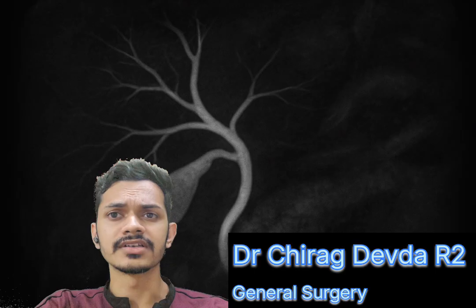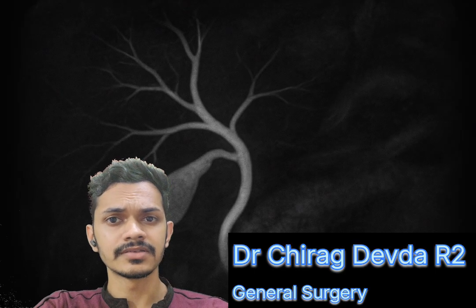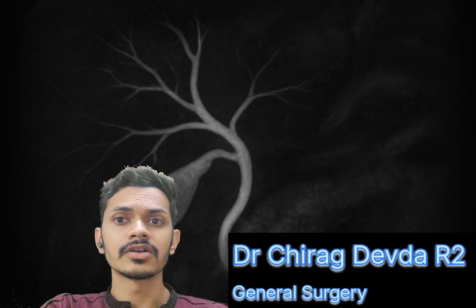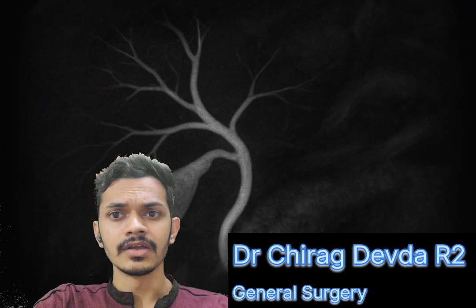If we talk about procedure steps, the patient has to be supine in the MRI scanner, and a heavily T2-weighted sequence is acquired in coronal or axial planes. A 3D thin slice sequence is reformatted in multiple planes. Additional T1 or T2 fat suppression or dynamic contrast-enhanced sequences are needed for surrounding structures.